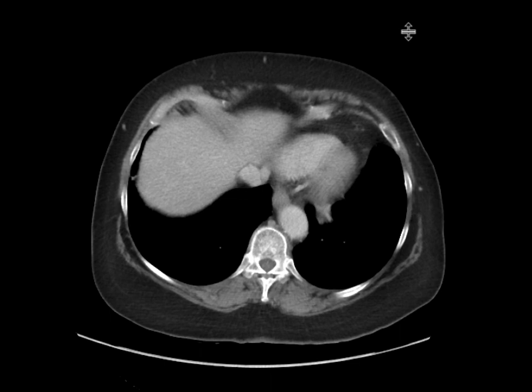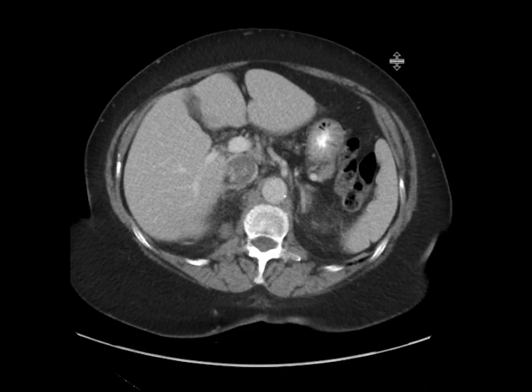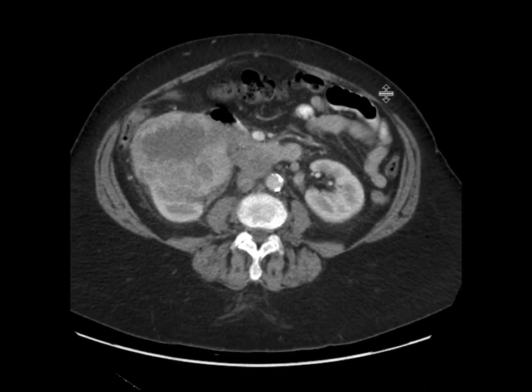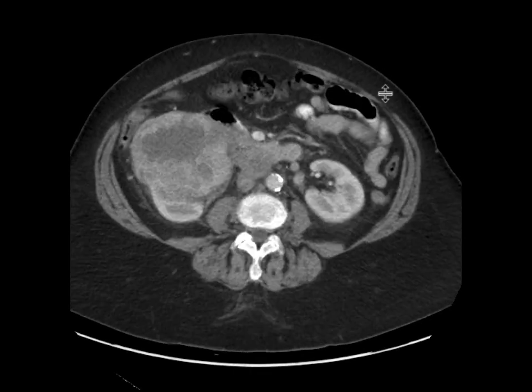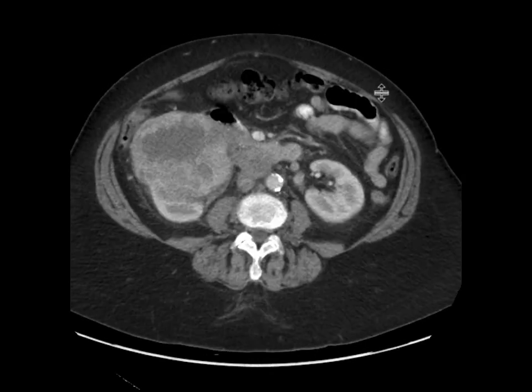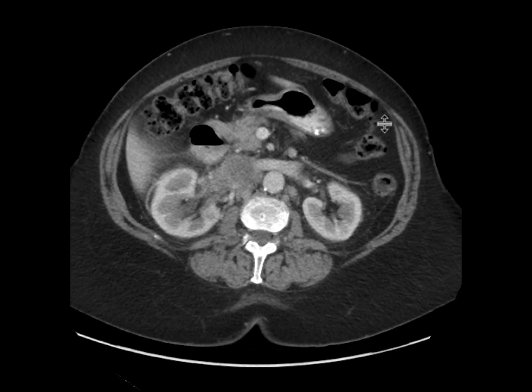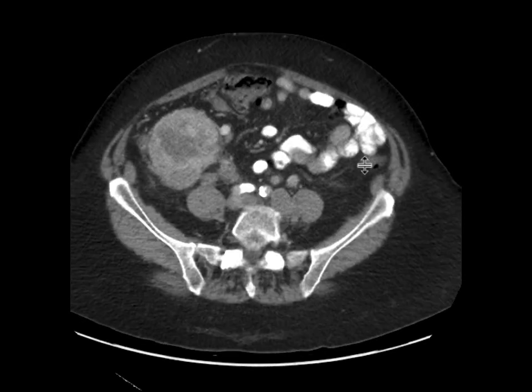This patient had come in with abdominal pain and lower extremity swelling, so we got a CAT scan with intravenous contrast. As we scroll down, we can see that there's a very large, heterogeneously enhancing mass arising from the right kidney. There's a region of necrosis within it as well, and so this appearance is really concerning for a renal cell carcinoma.